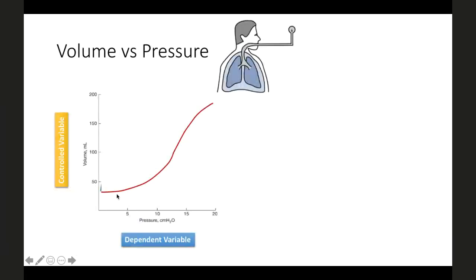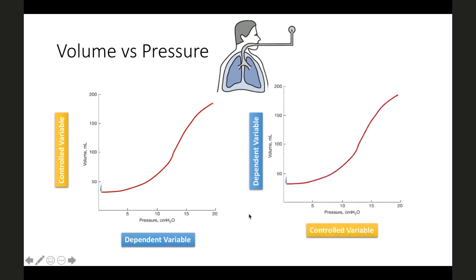So if you plot it, depending on the volume you are inflating, there will be a pressure change. So this we can see from a different angle. If you are going to control the volume, the pressure becomes a dependent variable, right? If you are giving 100 ml, it will come around maybe, in this example, 12 or 13. If you push in 200 ml, the pressure becomes 20. You don't have control over this side.